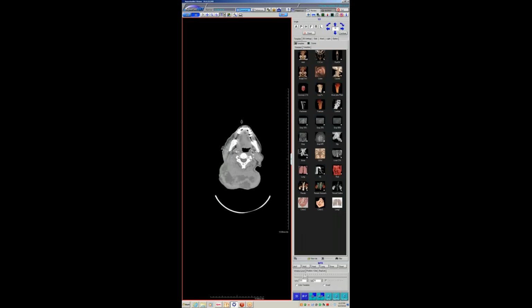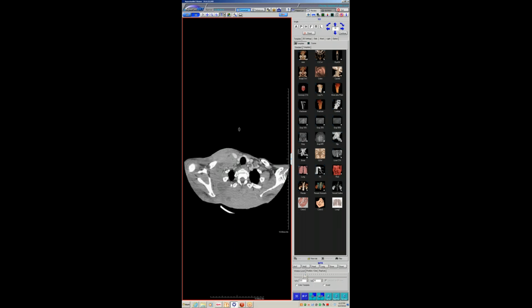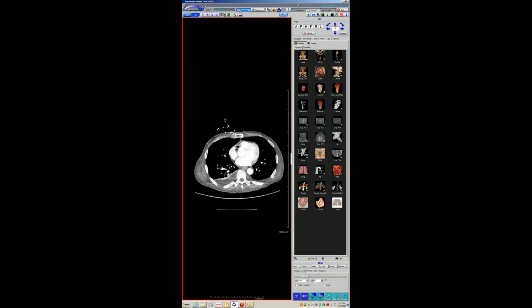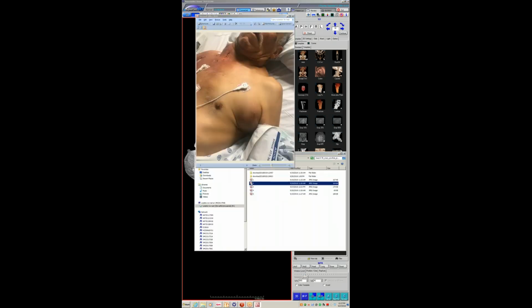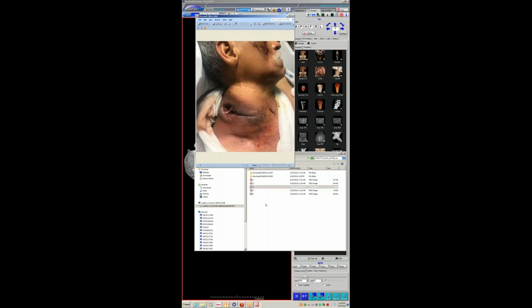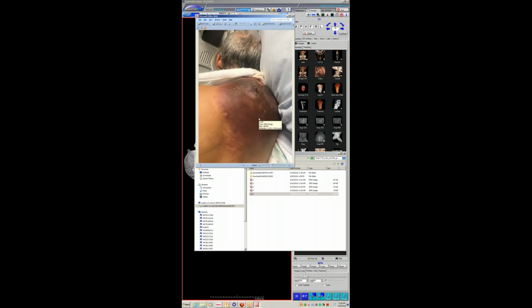So here is the neck CT with lots of interesting badness coming out onto the skin, extensive necrotic lymphadenopathy popping out onto the skin from the chest as well. You can see here these very nicely filled. Here's some of the stuff that's not popping out onto the chest. Here's some of the stuff that is coming out and communicating with the skin. Here's some of the stuff from the neck. And I was convinced I had seen my first case of scrofula.